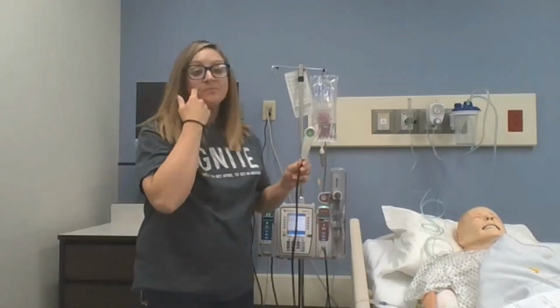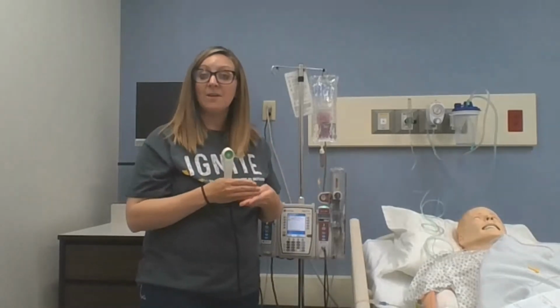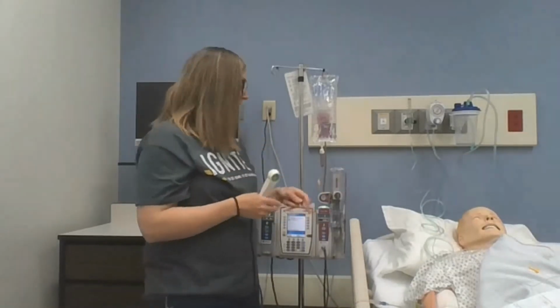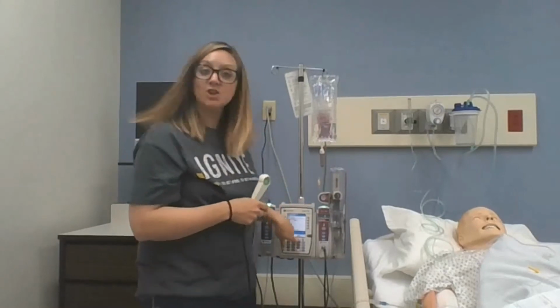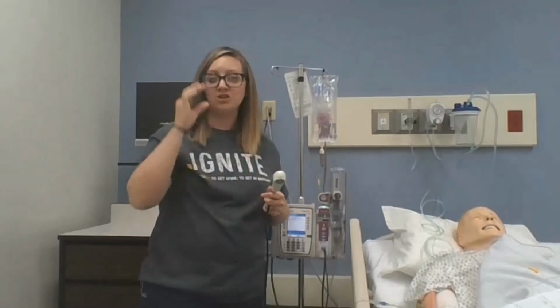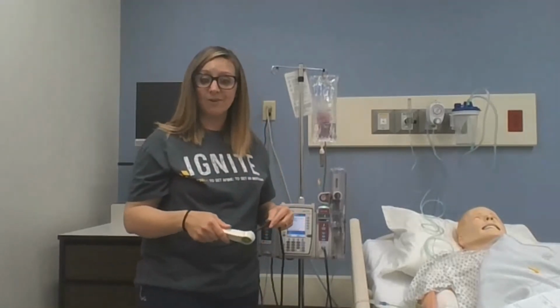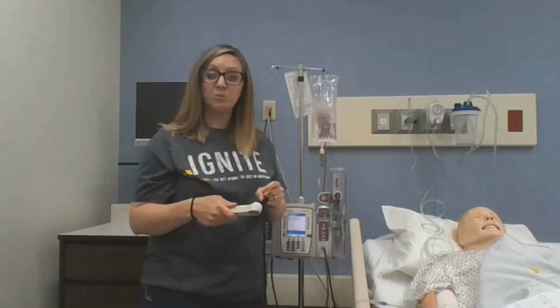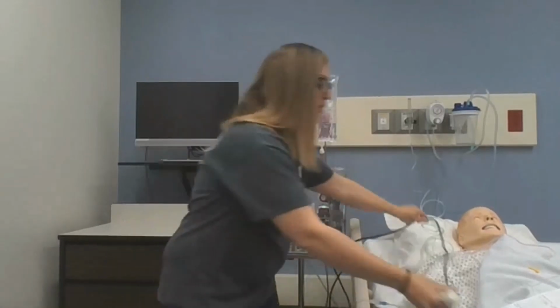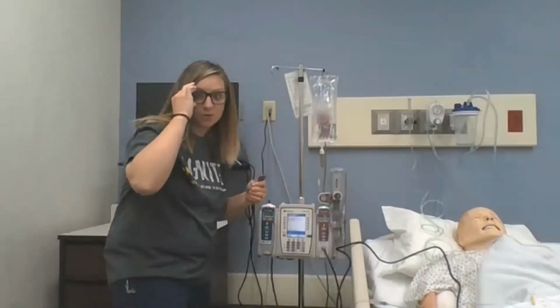At the end, or every 4 hours, you need to assess their pain and document their pain, and then also assess your pump and make sure that what's programmed is still what's ordered and that there have been no changes and that everything's appropriate. You also need to go in and check your history every 4 hours and at shift change when you switch nurses. I'm going to show you guys how to do that. And there's a place in Beacon now for us to chart all of this, so it's really fabulous.